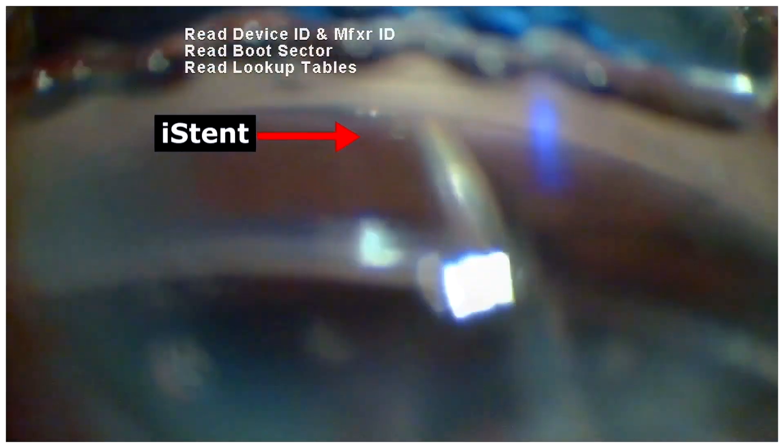Following which, the iStent can be gently tapped to ensure its stable positioning.